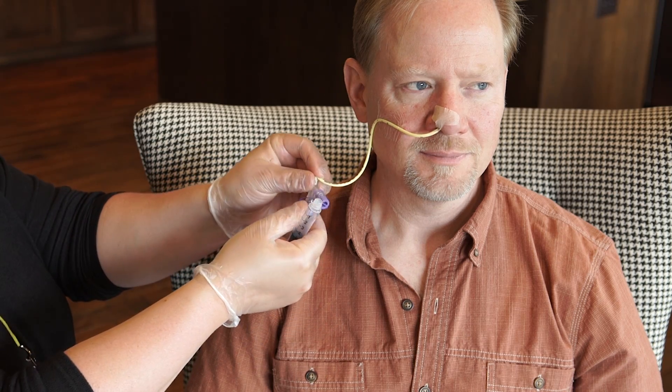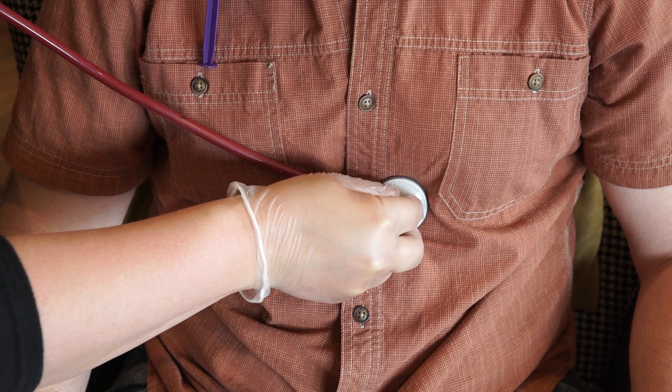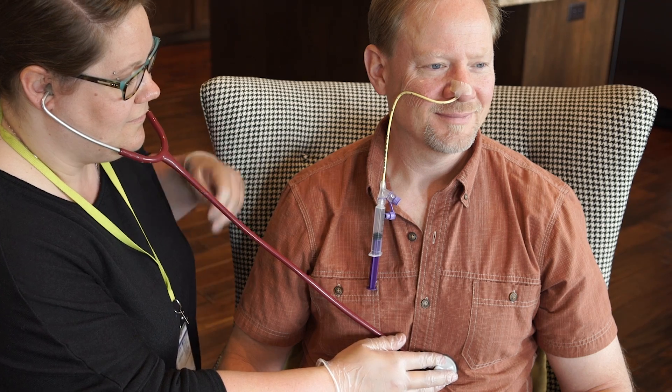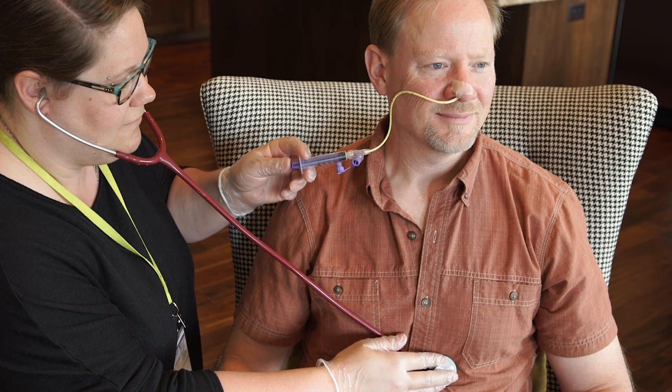Connect the syringe to the feeding port on the NG tube. Put the ear pieces of the stethoscope in your ears and hold the other end of the stethoscope flat on the patient's stomach. Quickly push the syringe plunger to force the air into the tube, and listen through the stethoscope for a pop or swoosh sound as air enters the stomach.